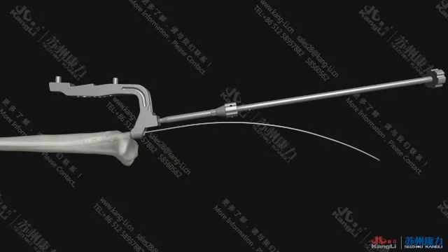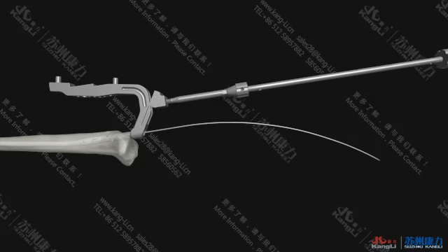Remove the leg connector and the ball guide pin. Monitor the placement with fluoroscopy at last.